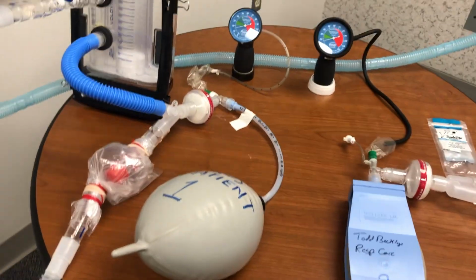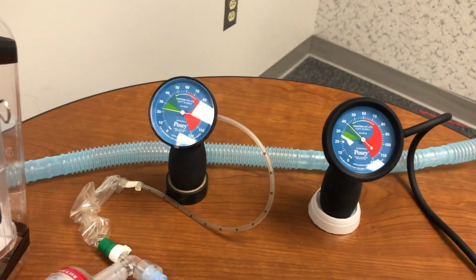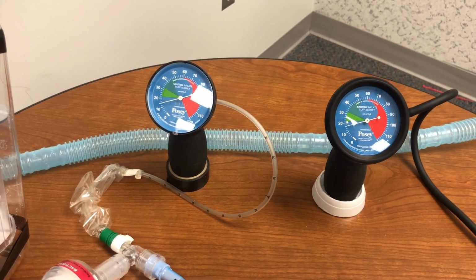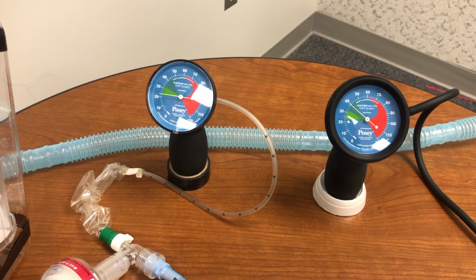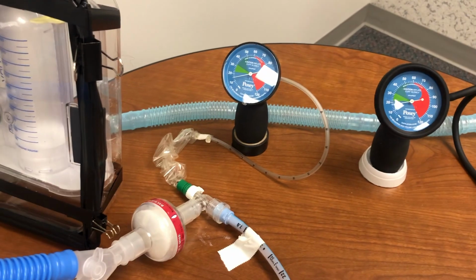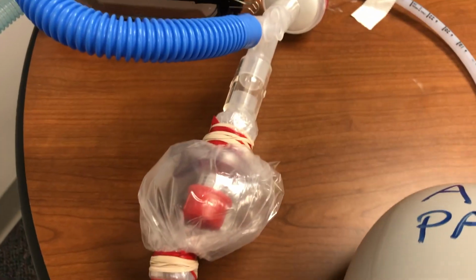So I have changed the PEEP to around 12. If you see, the patients have different PEEP now. This patient has a PEEP of 8 and the other patient has a PEEP of 12. And you can change it to higher levels, up to 20, 25, whatever you desire, depending on this valve.